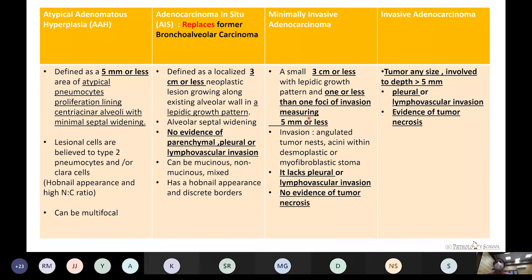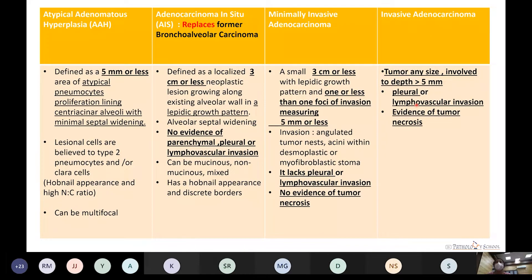In minimally invasive adenocarcinoma, stromal invasion is present in the form of desmoplastic or fibroblastic stroma invaded by tumor nests or acini, but there is no lymphovascular invasion or tumor necrosis. In invasive adenocarcinoma, the invasive component is more than 5 mm, with pleural and lymphovascular invasion and necrosis present.